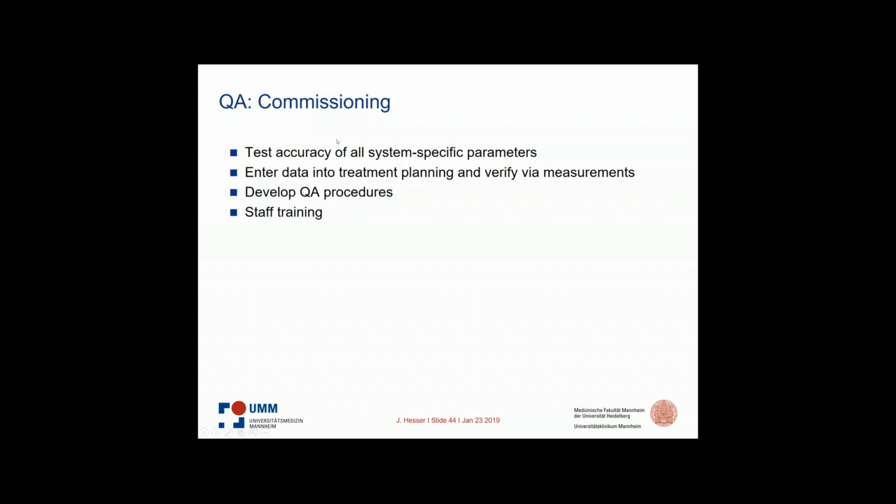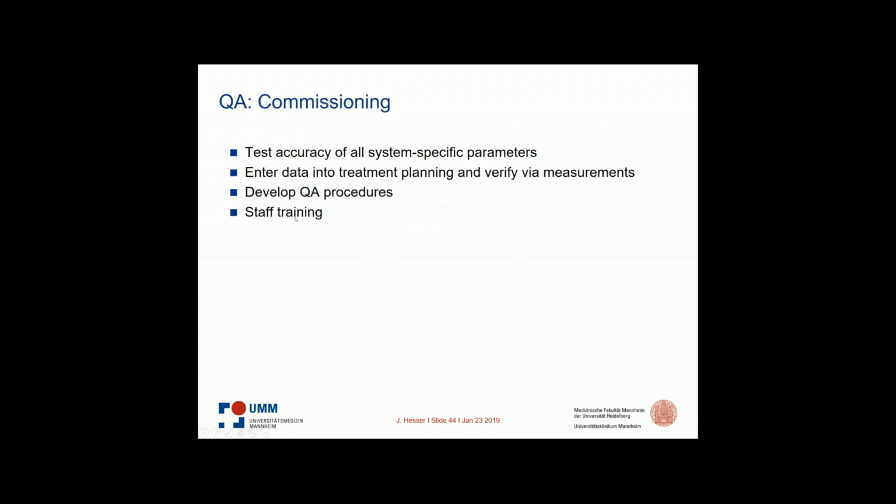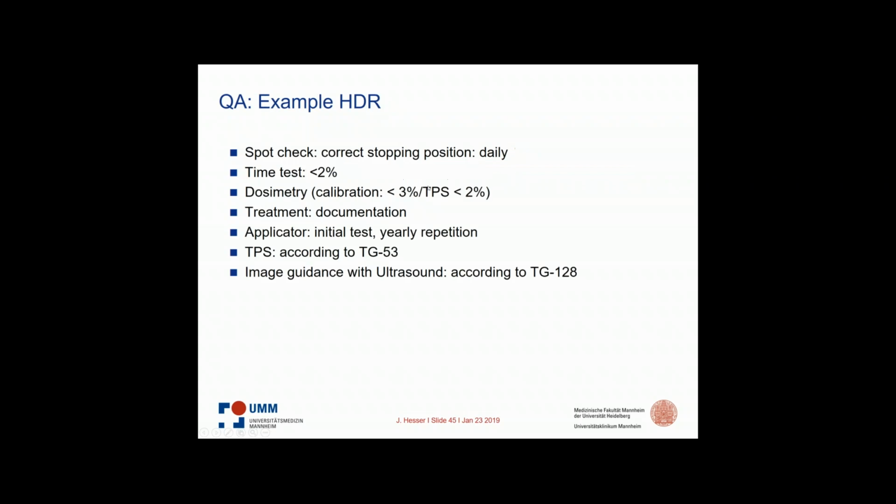Another point here is staff training and doing commissioning. It's a good starting point whenever somebody comes new, or when training should be repeated, to do that. Because, by the way, this is on the phantom side, and you can try out how the treatment process is working, how the planning software is used. When we do this here, you just get accustomed to how to do that.